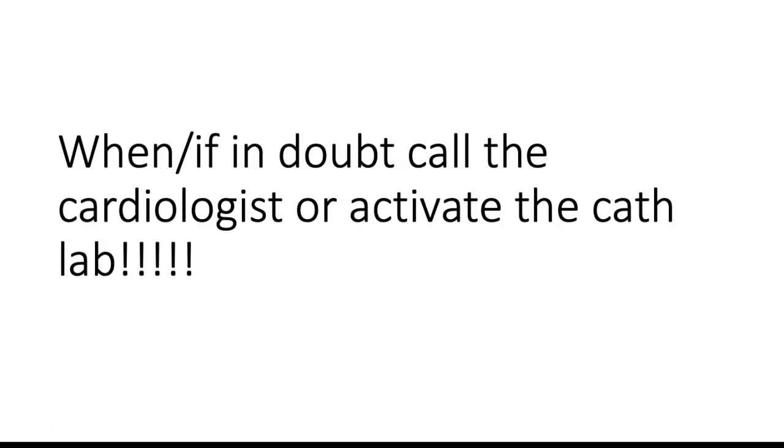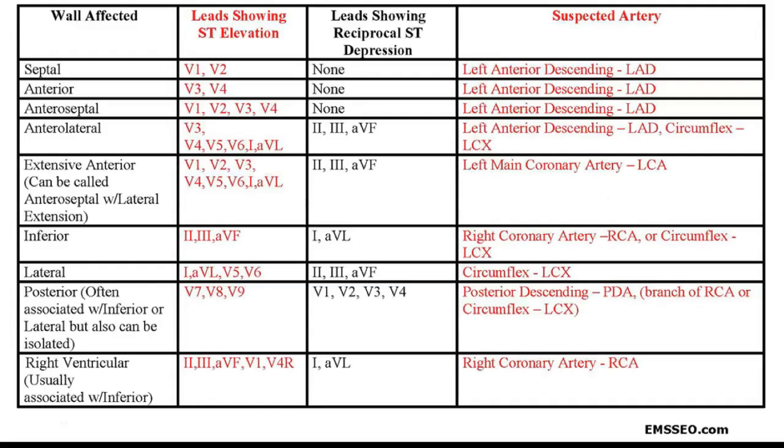Because time is muscle, it's better to have a clean cath in this instance than to wait for further damage to the heart. Again, I would remind you this chart is a really good depiction of the walls that are affected with the different patterns of STEMI, the areas for reciprocal depression or reciprocal changes, as well as the suspected involved arteries. This is really helpful.